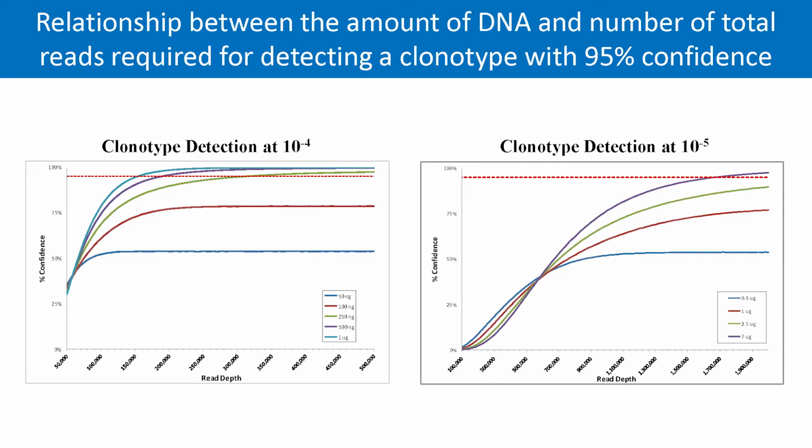So for a clinical assay, you have to decide how much you can actually get. Can you actually do this clinically? Can you get to that sensitivity without having to run multiple tubes and then have an entire run that is only that one patient? That's not something that we could possibly do with the assay for us.